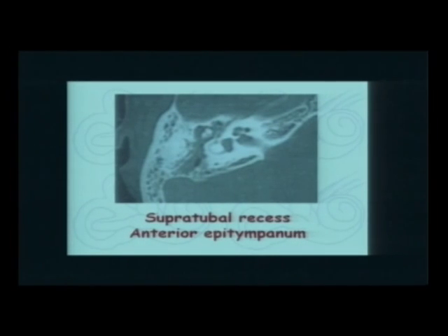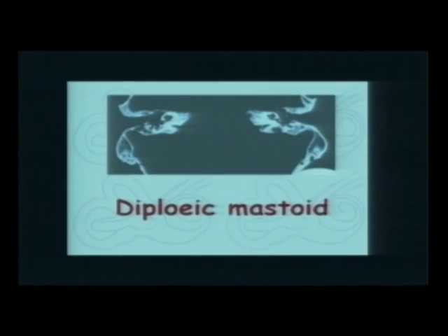And you're getting closer to the facial nerve as well, so you're scared of entering this area. Have to be very careful. And also you're scared because you're afraid to drill into the middle cranial fossa. It's this really difficult place, which is present between the middle cranial fossa dura, the facial nerve, in front of the malleus, and you're too tired at the end of your surgery. So please make sure that you've always cleared the anterior epitympanum.